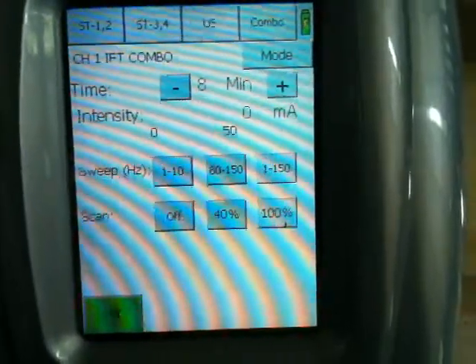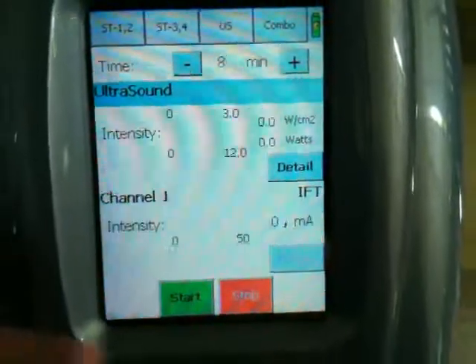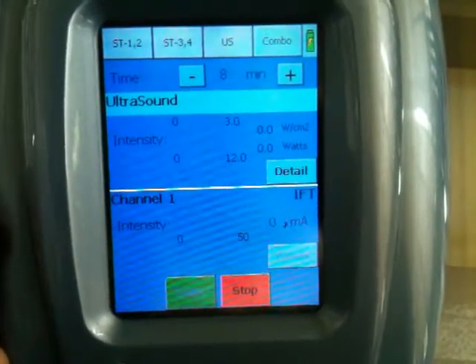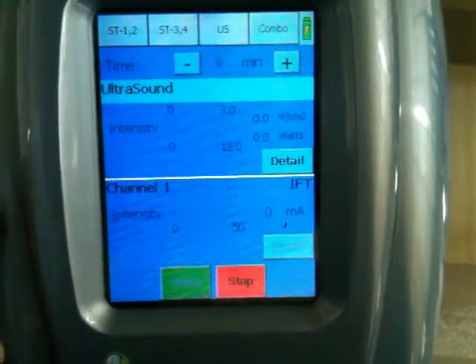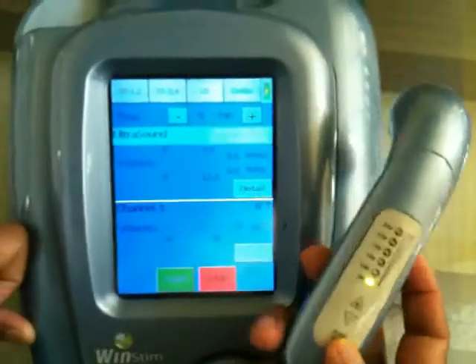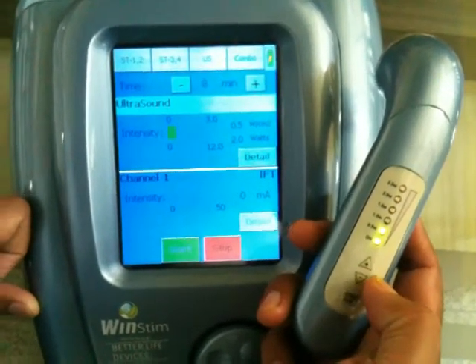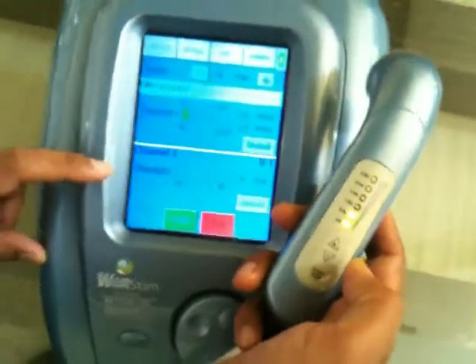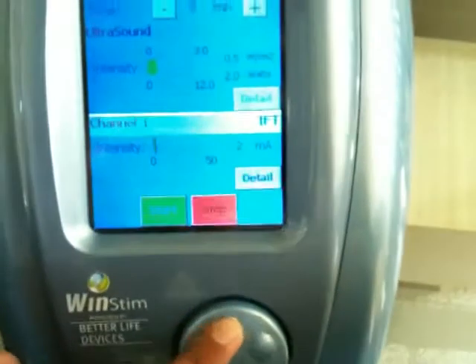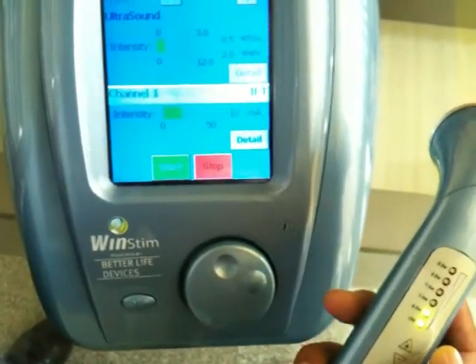You can set three frequencies and scan time. Now starting the treatment — both parts of the LCD have turned blue, meaning ultrasound is active and channel 1 with IFT mode is active. You can increase and decrease the ultrasound intensity using the applicator key, and for channel 1, by tapping channel 1 you can control the IFT intensity from the knob. This is the great feature — you can control both at the same moment.